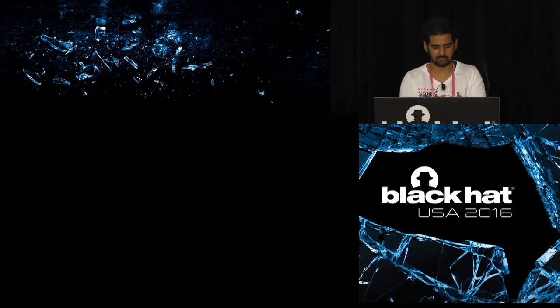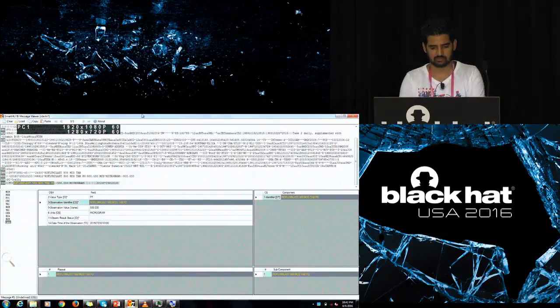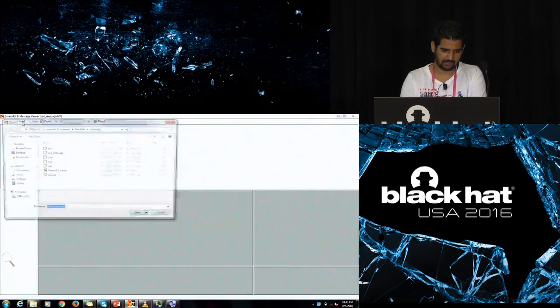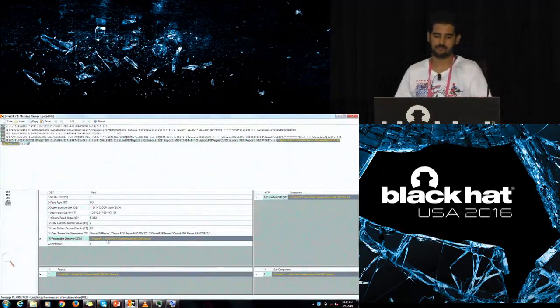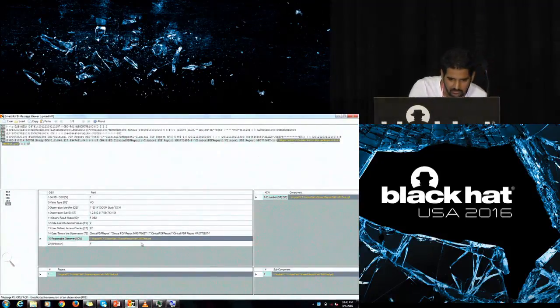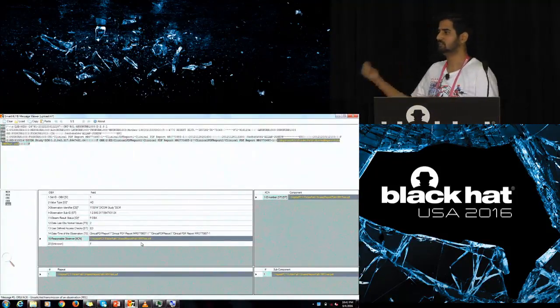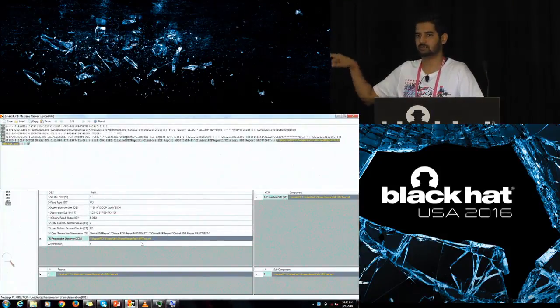Right? We'll see the particular segment which is responsible for this, and this is just one part of it. I'll just show how it looks. So let's say logo. Okay. So look at this. This is where the report is kept. It says MR test.pdf. Right? So if I were doing a man-in-the-middle attack, I'd change this. Or if you were pen testing these messages, change this message to actually point it to some other port on the same server.